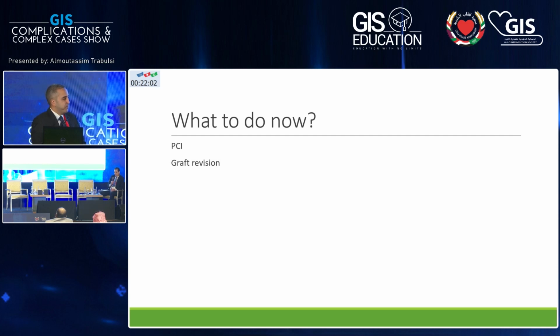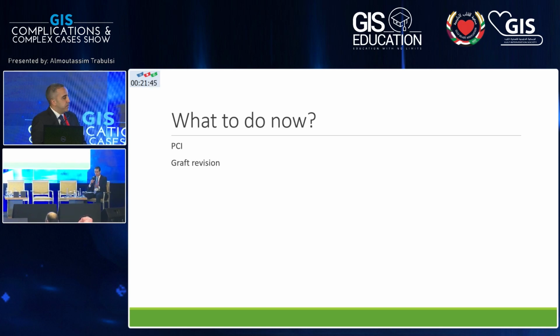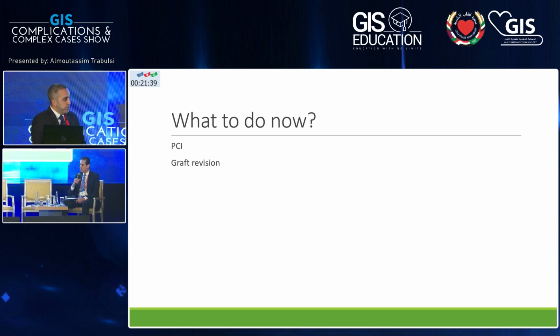Okay. Almost. So I think obviously continue with the conversation that we had, and I'll come back to the angiogram. Then while the decision is made whether to do PCI or graft revision, I think the discussion should be hemodynamic support while the discussion is going on about PCI. What was the thought process at that point? So at this stage, we went with the PCI option.